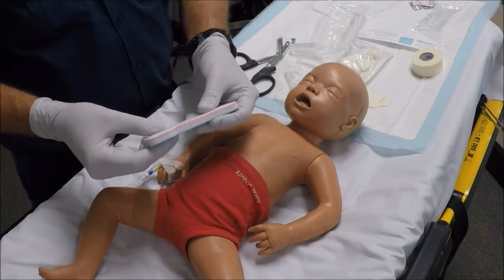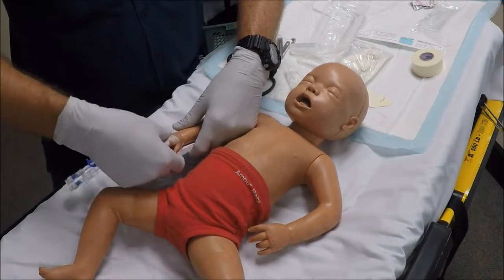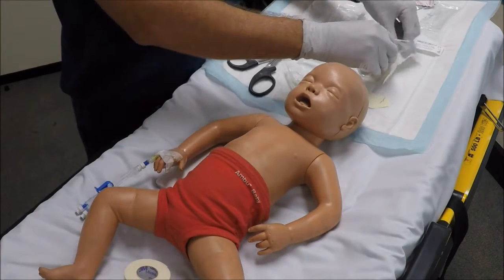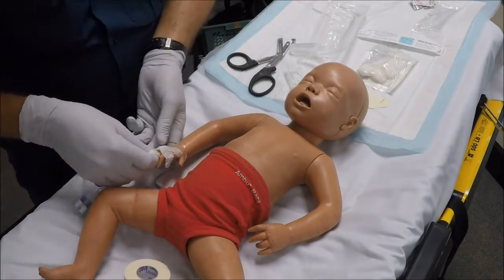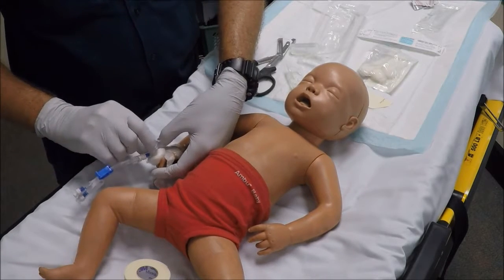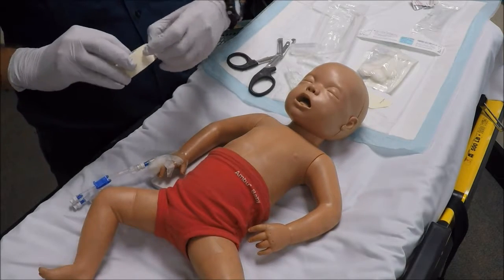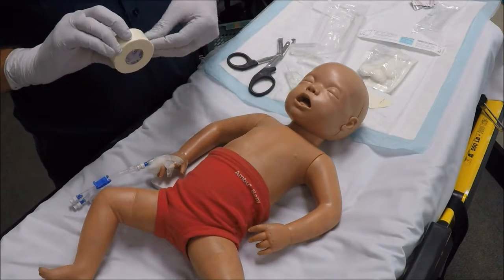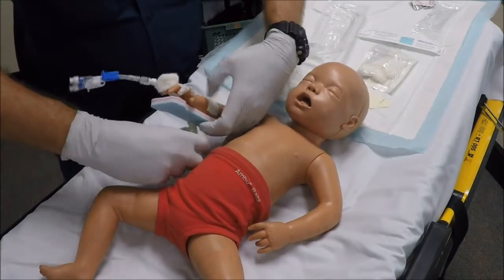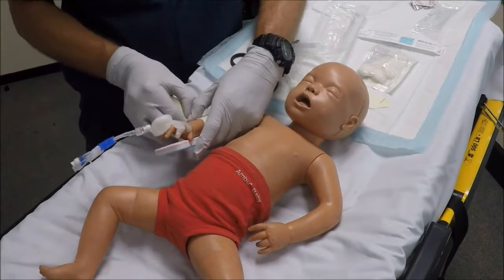Some colleagues obtain back splints from the hospital — the idea is that it keeps the angle of the wrist stable so the patient can't kink or occlude the cannula. Also, paediatrics are very susceptible to pressure injuries, so it may be pertinent to place a cotton ball or a piece of gauze underneath the cannula hub to reduce the risk of pressure injury from the cannula onto the patient's skin. The dressing and tape should be checked at least hourly — not an issue pre-hospital, but on a long transport you want to ensure you're not getting pressure injuries under the tape sites.